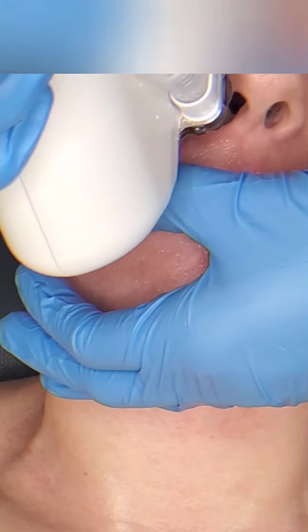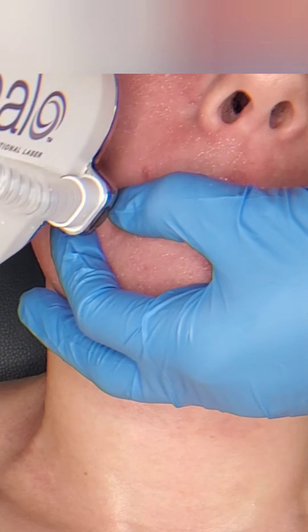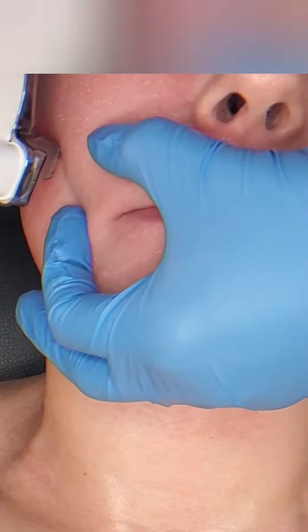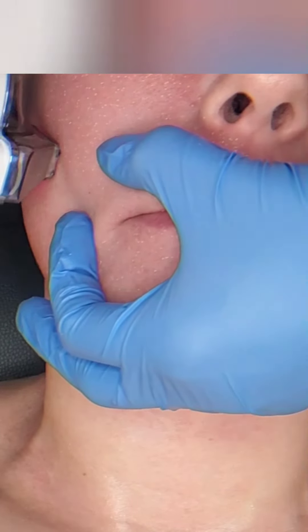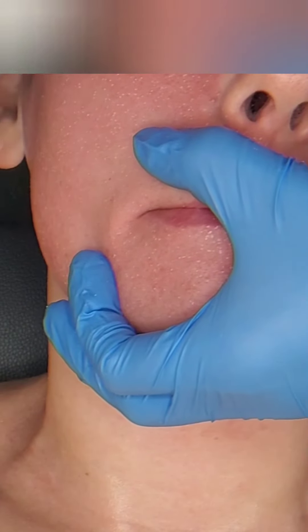Anytime someone comes in saying their texture is terrible, their skin is dull, it's not bright anymore, or they're starting to see the beginning signs of aging — I say Halo, Halo, Halo. That's my go-to.